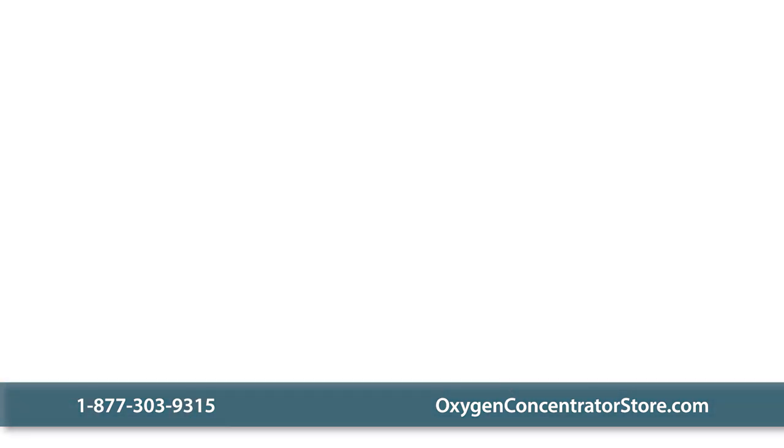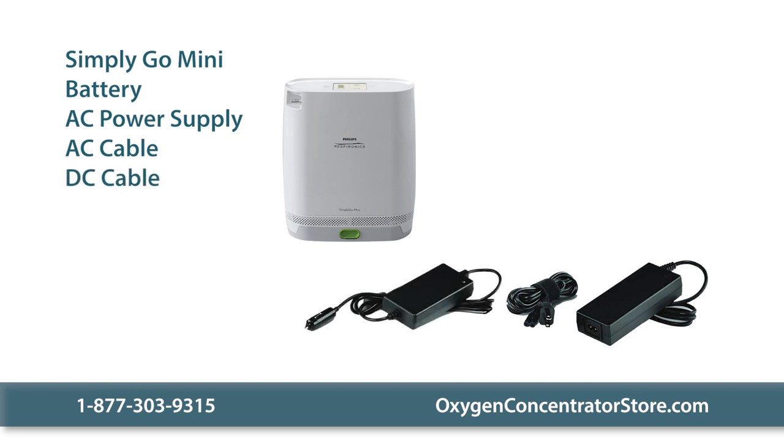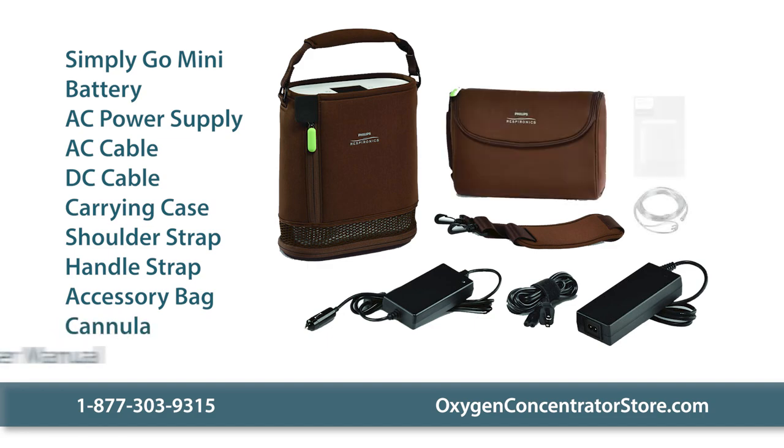Your order includes the Simply Go Mini, a standard battery, an AC power supply, an AC cable and DC charger, a custom carrying case, a shoulder strap, a handle strap, an accessory bag, a cannula, and a user manual.